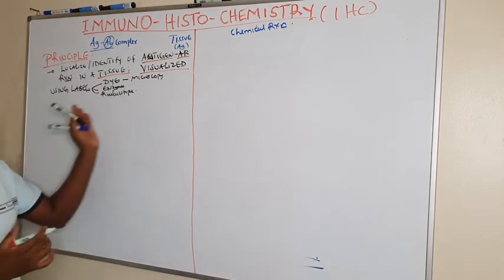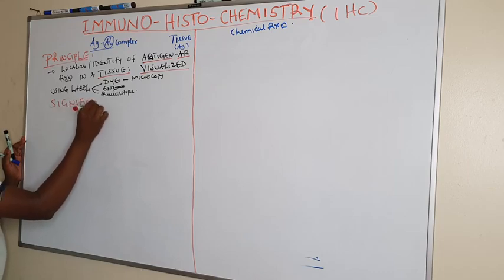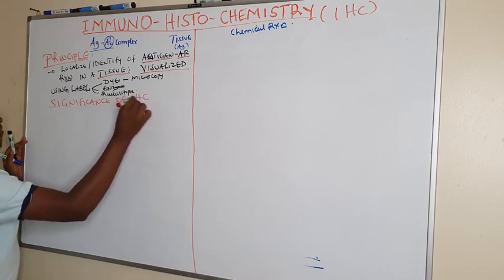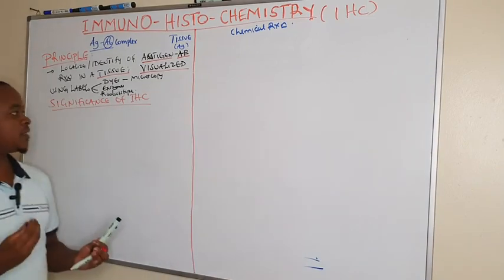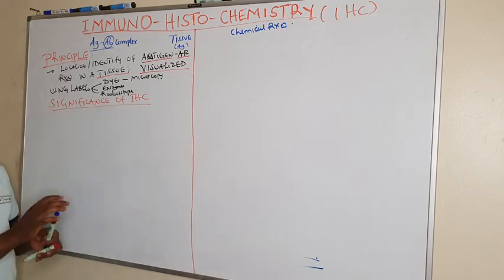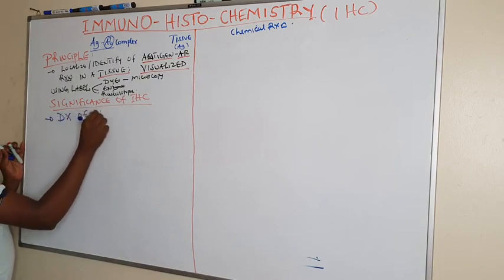After knowing the principle, now we must know the significance. Why immunohistochemistry? The significance of IHC. One of it is for diagnosis of cancers.